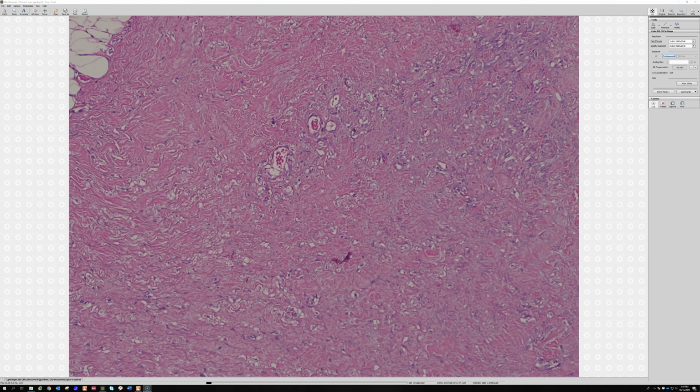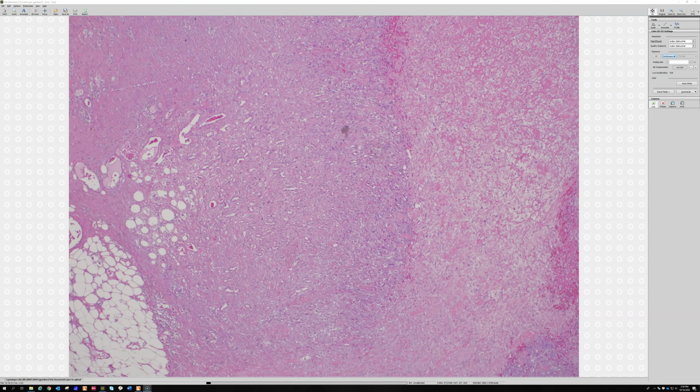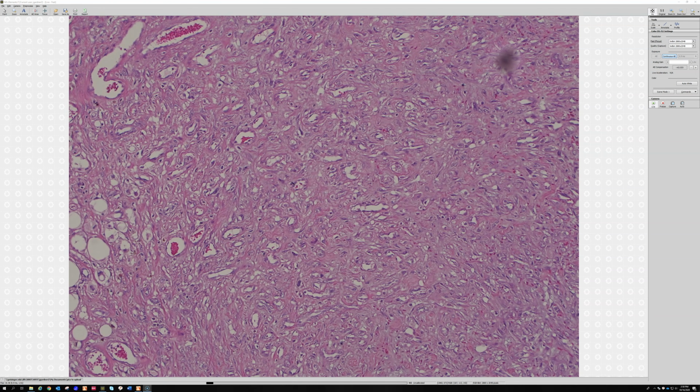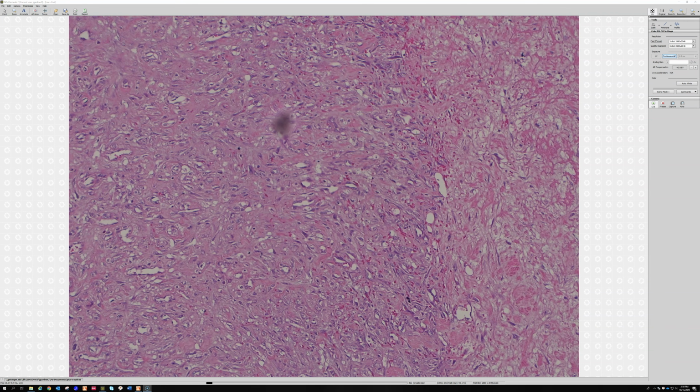And you'll often see proliferating blood vessels out in that area around the outside too. They're right there. That looks like granulation tissue, see? It's that proliferative, revved-up vessels and reactive myofibroblasts that you'd see in granulation tissue. So the zone of ischemic-type fibrinoid necrosis in the middle, surrounded by fasciitis and granulation tissue, surrounded by scar, that is typical of ischemic fasciitis. That's what this is, ischemic fasciitis.